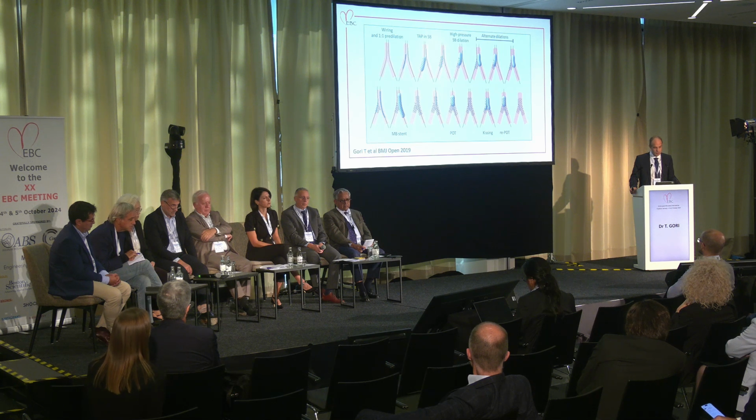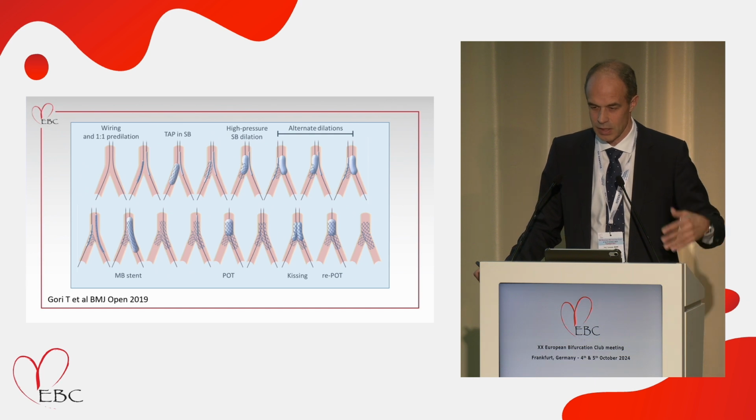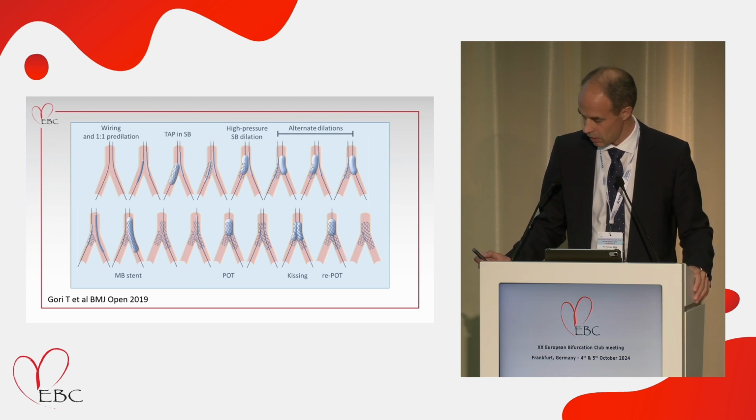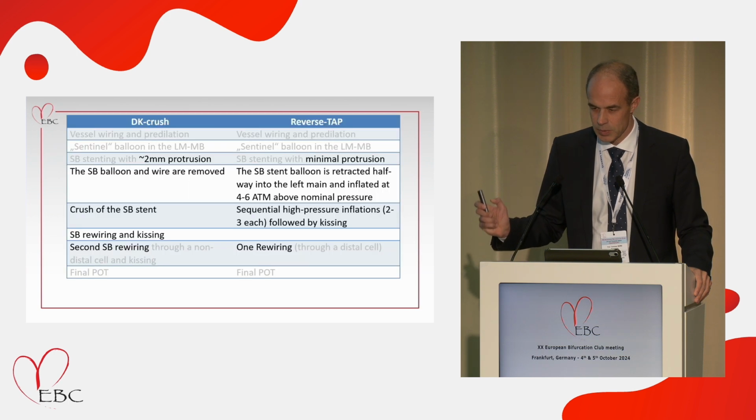The next steps will be very similar to the DK crush technique: implantation of a main branch stent, rewiring of the side branch, the only rewiring necessary in this technique, and then kissing and repot, and then the final result. So this was an animation which I skipped.